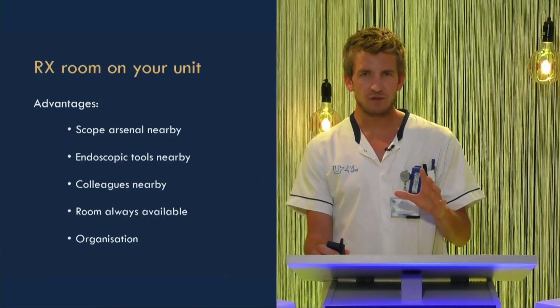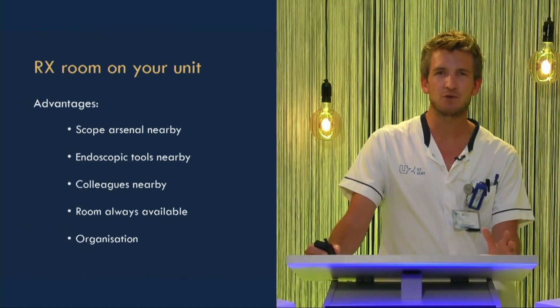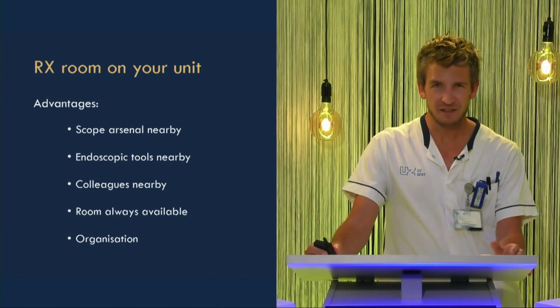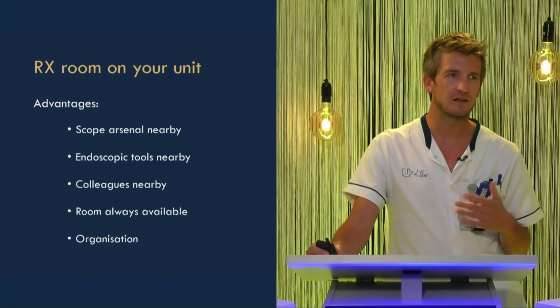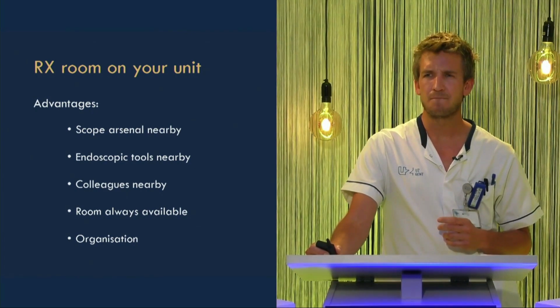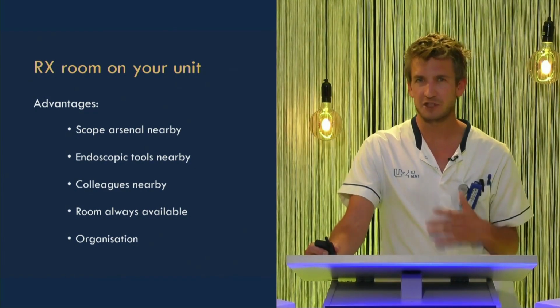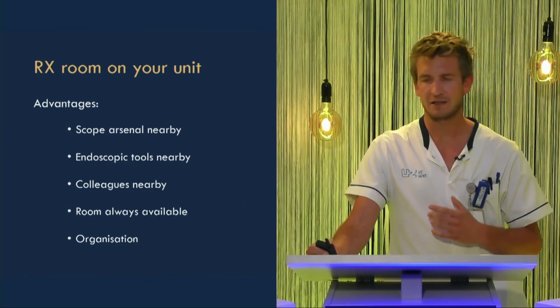Since a couple of months, we have our own X-ray room in our department, and we see many advantages. We now have everything nearby. We have the scopes, our endoscopic tools, and even the colleagues are nearby. We have the room always available. We don't have to share it anymore with other departments. So it's very easy to organize our program.